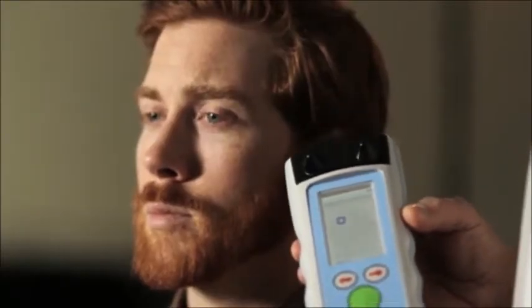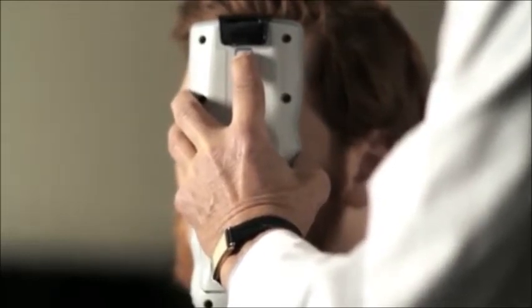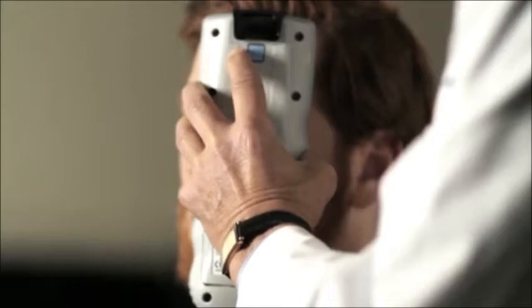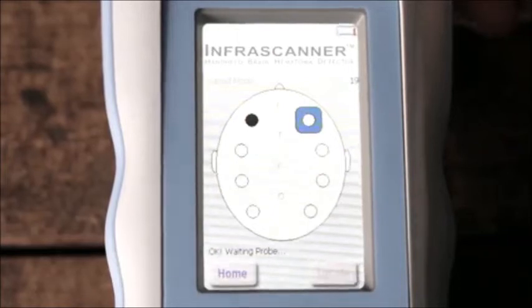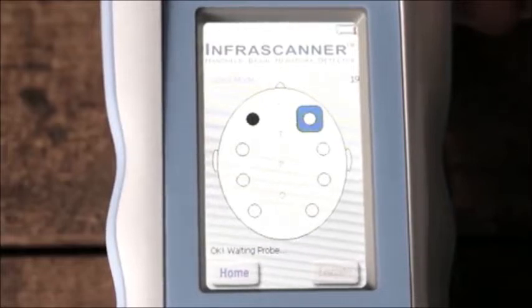So we're now going to do an infrascanner examination, and we begin by marking the left side of the head. When we do this, we select a point in the mid-pupillary line between the hair and the eyebrow to avoid the frontal sinuses, which are about here. And we place the fiber optic probe firmly, but not too hard, and click until we hear a signal, and we see a blue square shows where a measurement is to be taken. The black dot will appear after the first measurement on the left side.